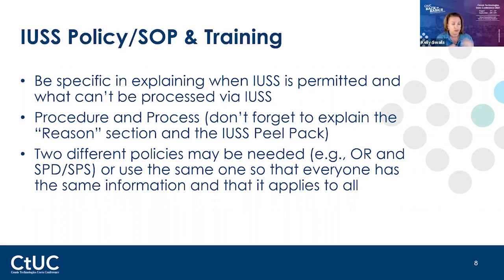You look at the foot and ankle tray and you see there's one sitting on the shelf. You run, grab it. You totally just avoided a whole IUSS need by simply using that instrument search and seeing what's available and where it's at. Now that's probably going to be more your ORs that need to use that, but it's easy to use. They would probably much rather learn that and use that than having to scramble and run around or IUSS something that maybe they didn't have to.